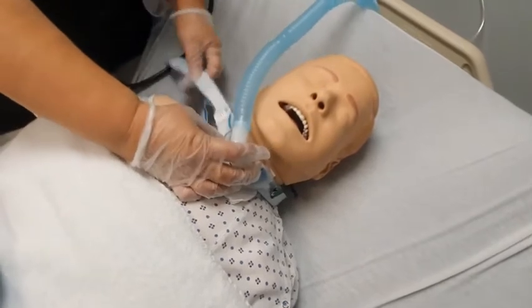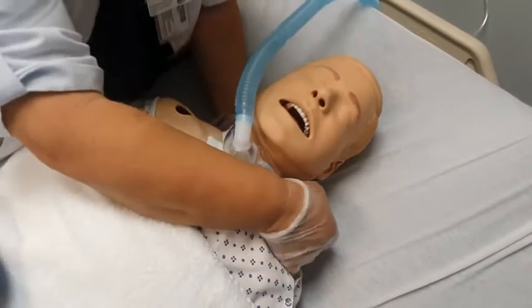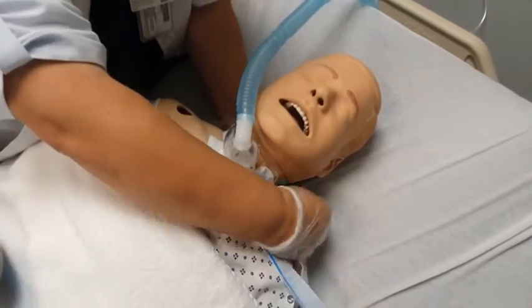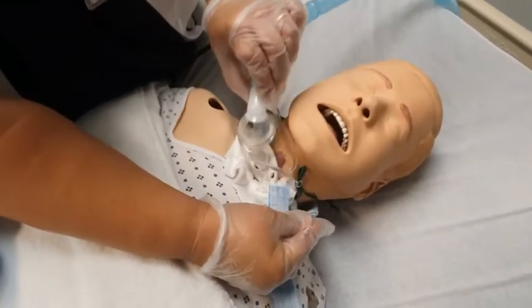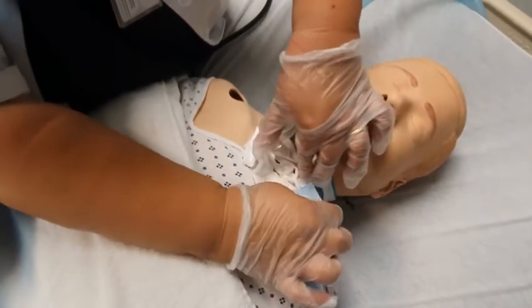You'll take this one around the neck at the back. You can pull the other one as you're holding on to the other one. Pull it through right here. This part, you may have to slide it over just a little bit so you can see. And you see how this one is still connected here.